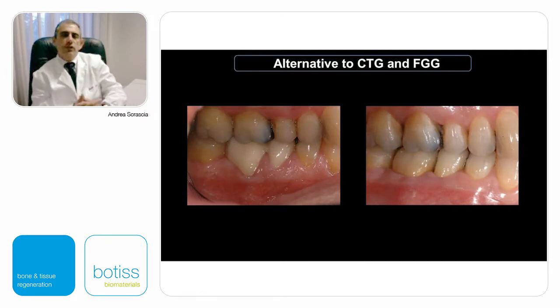Picture of the finished result of the clinical case, where we can notice the augmentation of the keratinized tissue that took place on 4.6, where the distance from the mucogingival line is clearly visible, and also the resolution of the first grade gingival recession on 4.3.